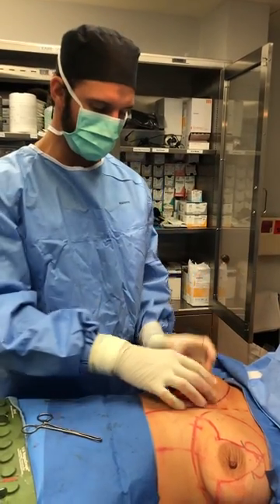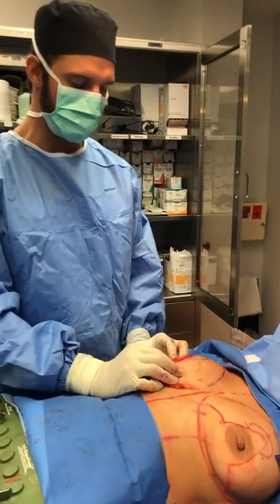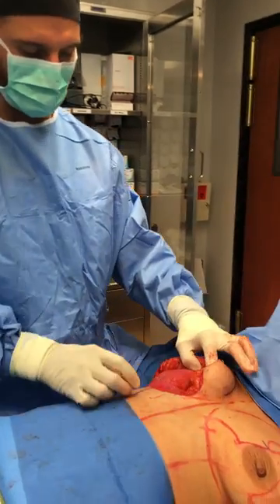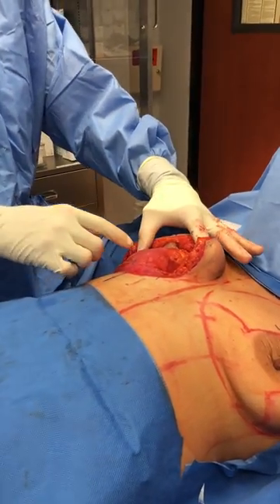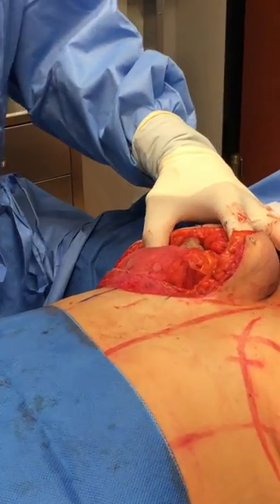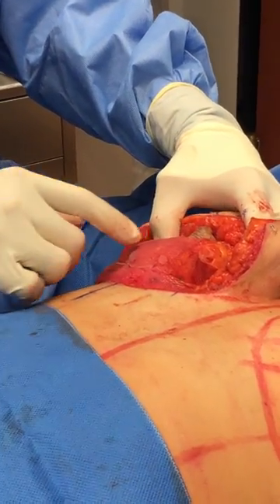Hi guys, welcome back. Dr. Rossi, we've completed a big portion of our right mastopexy here, and what I'm using is something that's becoming more and more popular, which is called Gallashape. There's Galladerm, Gallaflex, and Gallashape.